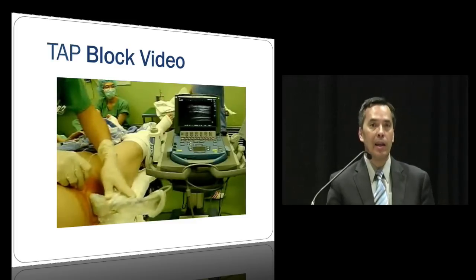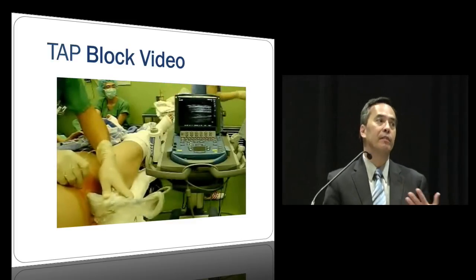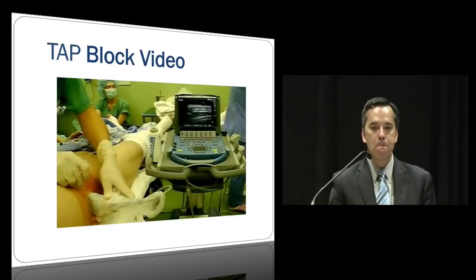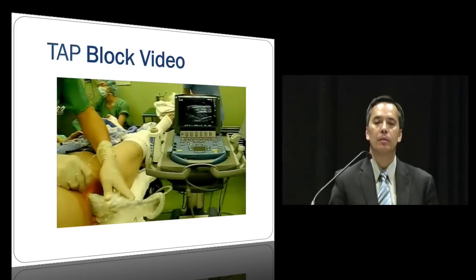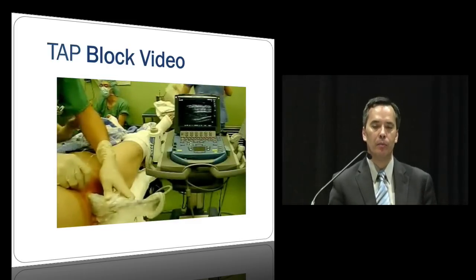And so this is a bilateral. So not only do you do one side, then you have to go and do the other side too. And you see the needle going in, and then we'll move on after he ejects the local. It's about a 4.5-minute video, so we'll cut it.